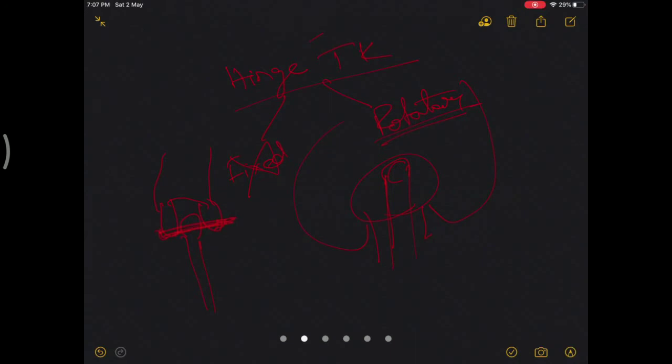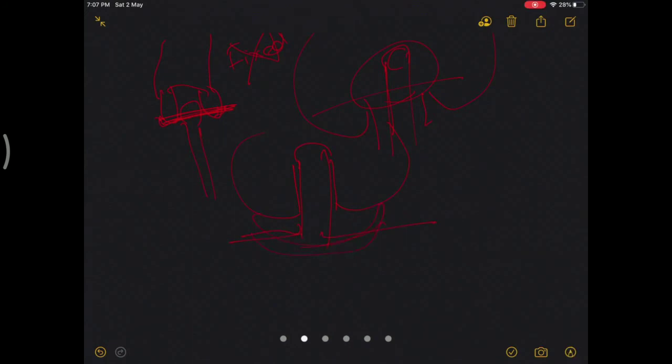Here it is not fixed. It has a huge barrel in the femur, and in that goes the huge stem of the tibia. This allows rotations, however, but it will not allow any anteroposterior or mediolateral instabilities.